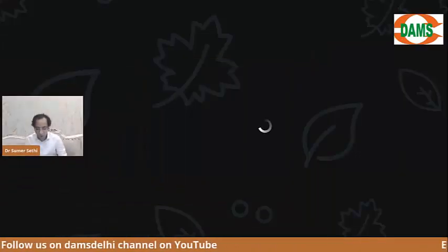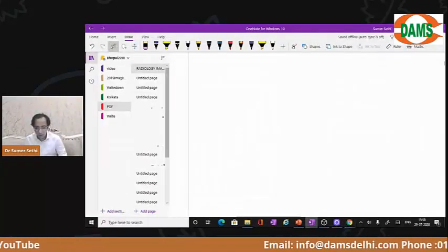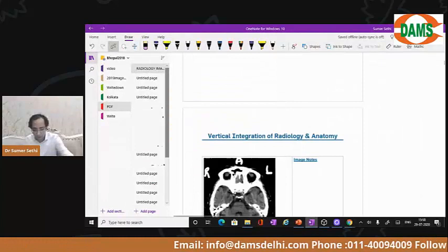So I hope we are all back here. There is a slight thunderstorm going on in Delhi right now, so the power is a little erratic here. But I'm back, don't worry. So my internet will fluctuate in between. Don't worry. Okay, once you're clear, I'm coming back to the same image again. This is where we were when we had a power failure here.